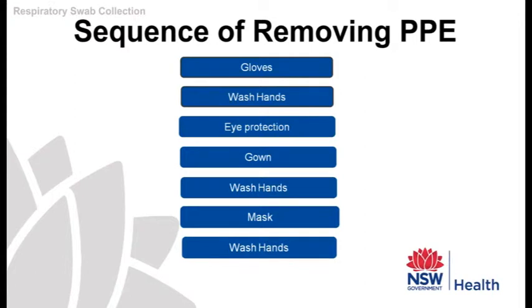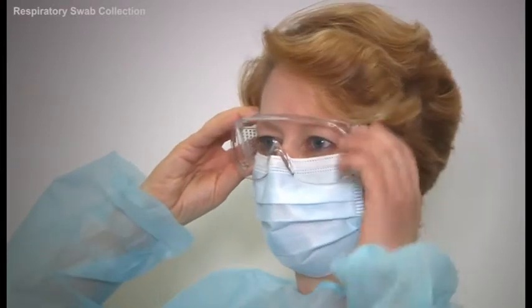First, remove your eye protection. Always try to remove the items from the back, as they are less contaminated.